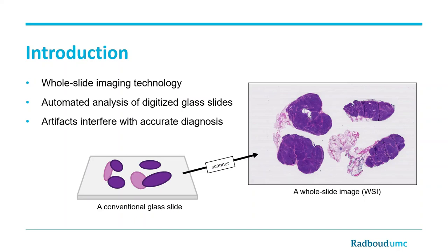Whole-slide imaging has led to several opportunities in the field of computational biology. An important example is the use of artificial intelligence for automated analysis of these histopathology images. However, artifacts may interfere with accurate diagnosis by pathologists as well as deep learning-based decision systems. As manual inspection is a time-consuming process, this calls for an automated quality control system that can propose solutions for a more accurate analysis.